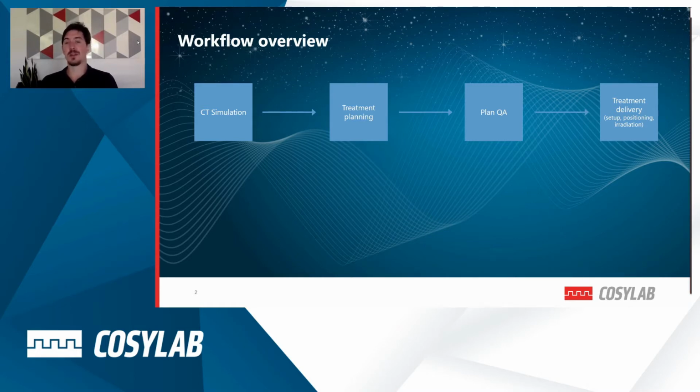In theory, each patient could be replanned daily with proper imaging. However, we all know that in the current setup, the clinical personnel usually lack the time to analyze each patient's fraction. A lot of data is generated and acquired during the treatment, most notably the cone beam CT or in-room CT images, but they're not really used afterwards to facilitate the treatment process. And we want to change that.